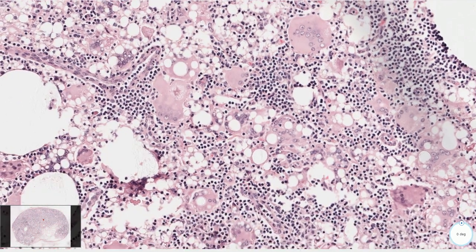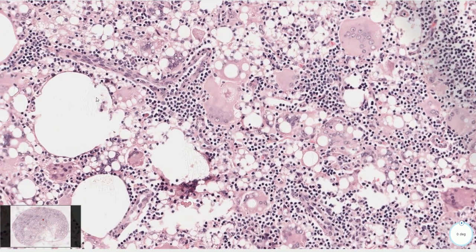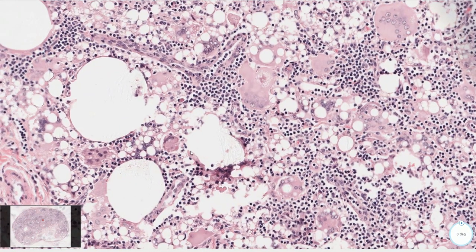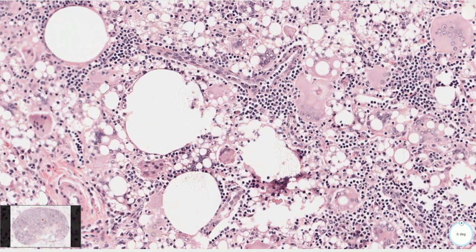Most of the silicone material was dissolved during tissue processing. But here and there — like here, for example — we can see some residual silicone material which is refractile but non-polarizable. So if you take a look at this slide with a polarization filter, you wouldn't see any polarization of this foreign material.